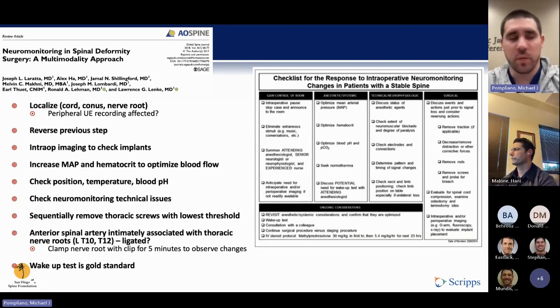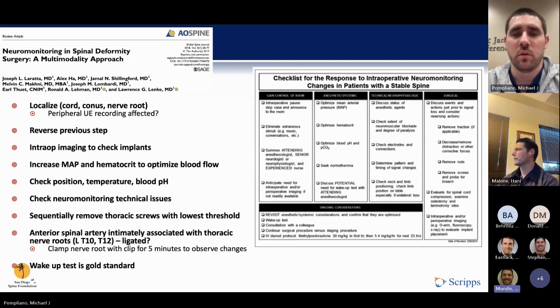Thanks. Dr. Mundis, is there a set protocol with the anesthesiologist for your deformity cases? Because it seems like that has a big effect on a lot of this. Thinking back to cases I've seen, I'm curious whether they all use the same anesthetic approach, or does that vary a little? They do not. I do wish we were 100% all on board, but the vast majority of our anesthesia group that works at Green have a very good understanding of TIVA, and they all will do some version of it.